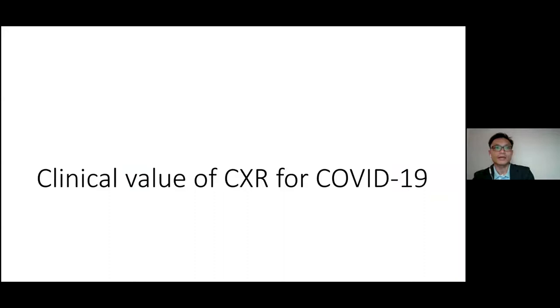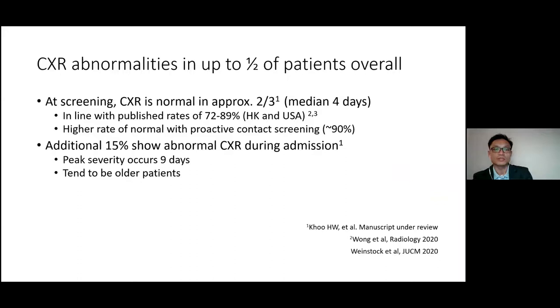Okay, I shall now share the evidence for use of chest X-ray in the management of COVID-19. As we all know, it is probably the most widely used imaging modality for management of the patients during this pandemic. And there is no doubt that the sensitivity of chest X-ray is lower than CT, with only about up to half of patients overall showing abnormalities on chest X-ray. In fact, 2/3 of patients actually present with a normal chest X-ray. This could be because the subtle ground glass opacities that are encountered in the early stage of the infection are not well depicted on chest X-ray.